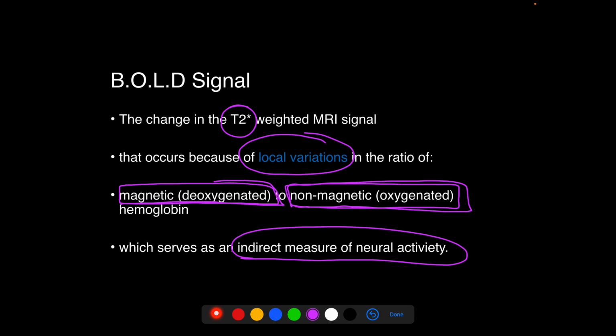What BOLD stands for is very simple. It is the blood oxygenation level dependent imaging. So it's just as the name suggests.